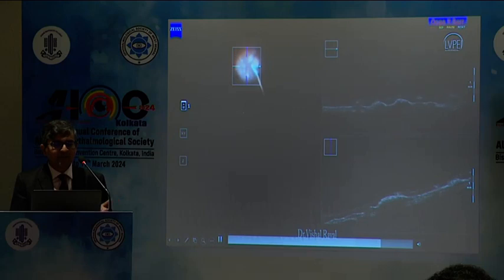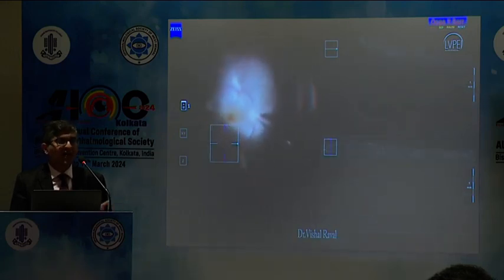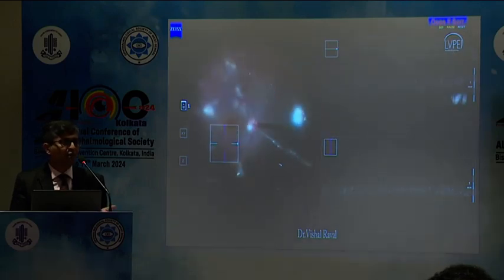So this can be done without intraoperative OCT. If you have it, it is good. Otherwise, as a retina surgeon, I think we are very confident we can easily do this. So it's not something novel.